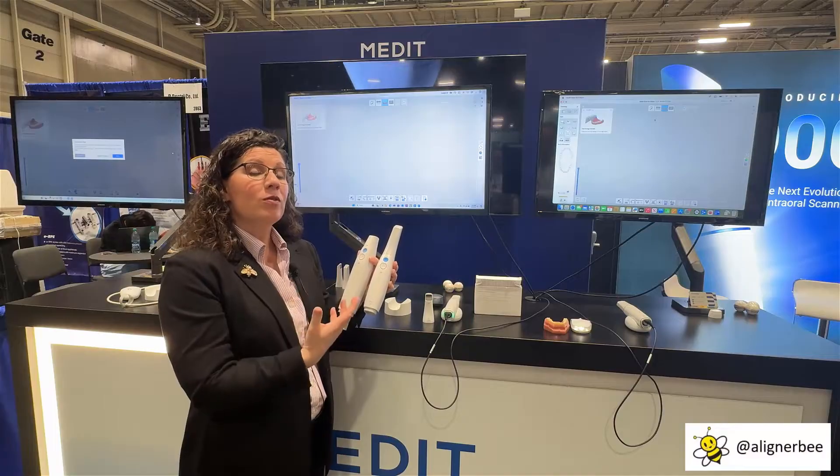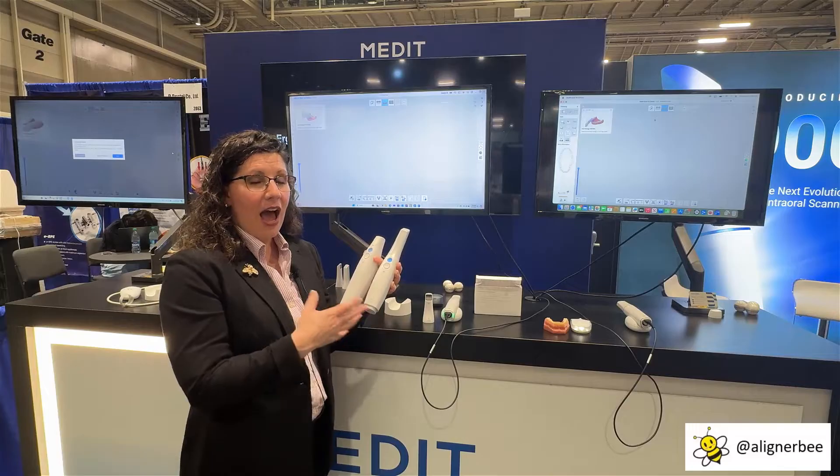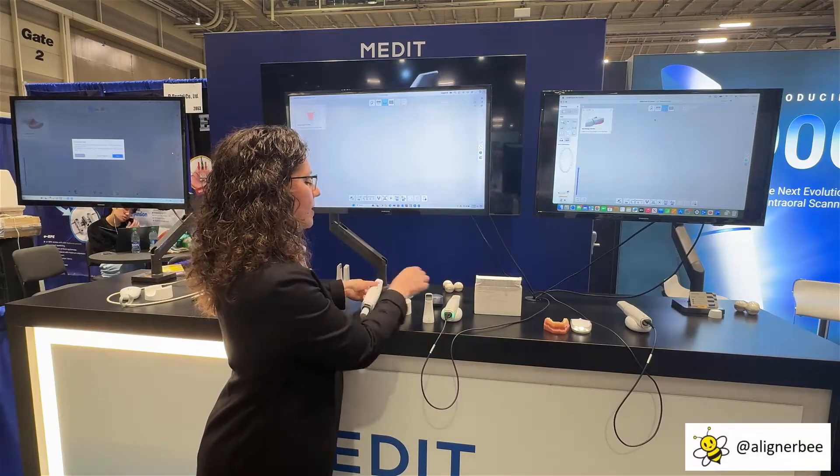We utilize them in our practice because of the scanning speed and versatility with our patients. I'm very happy to see the trend that Medit is going towards, creating a lighter weight scanner that's easier to hold in the hand.